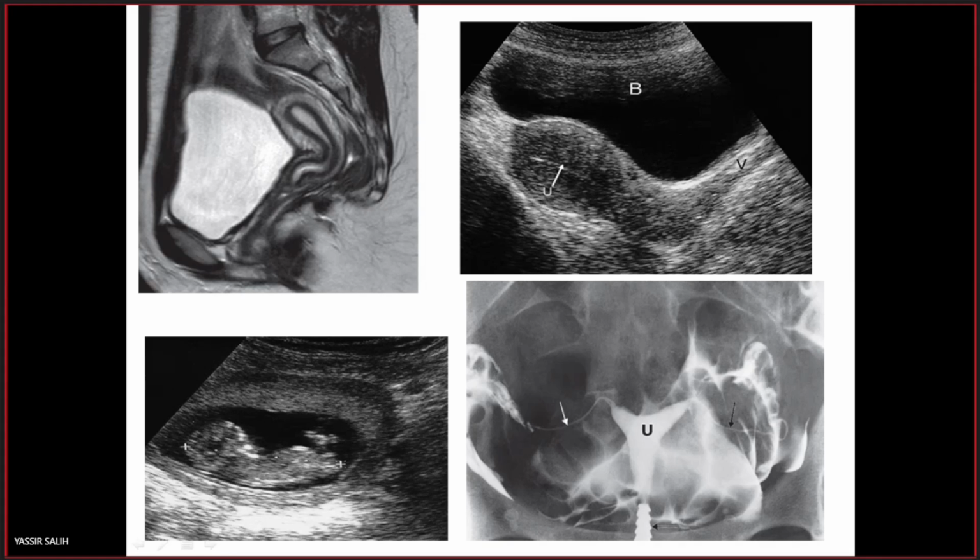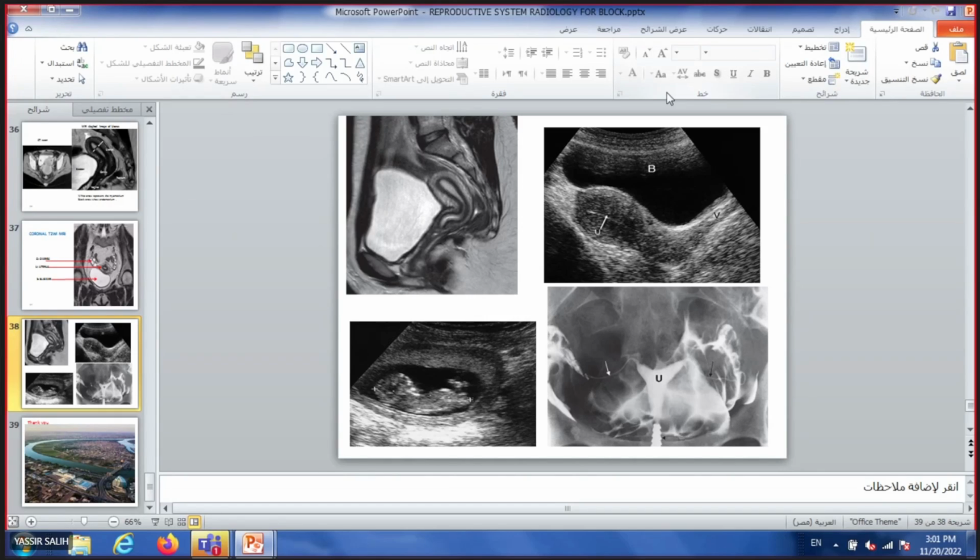We need one of you to answer my question in this last slide. Any volunteer? Start with this one. What is the imaging technique? Ultrasound. Ultrasound. You can write on the chat.